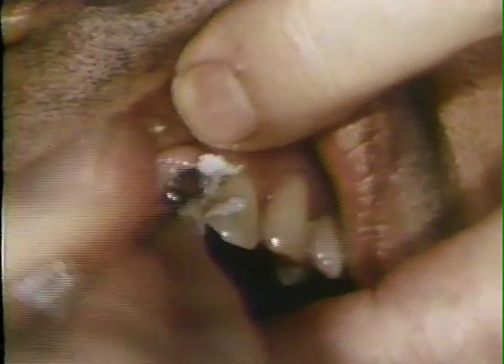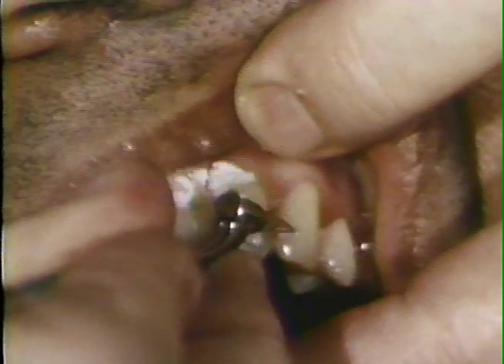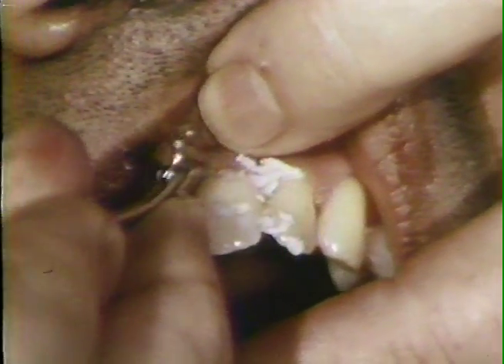Polishing paste is first placed on the teeth. Then, the polisher is moved up and down and extended into the gingival crevice as deep as possible without causing discomfort.